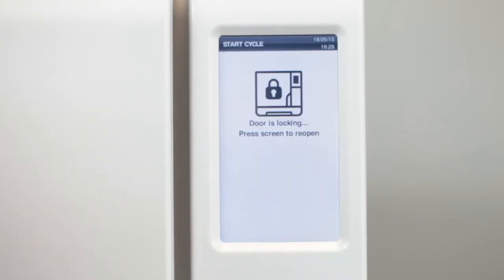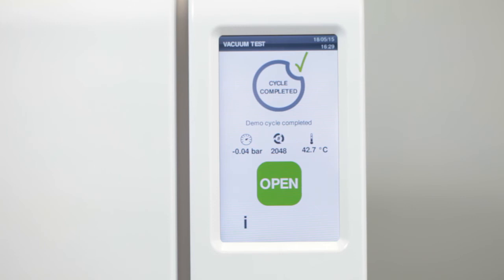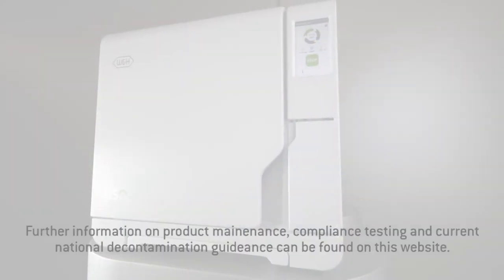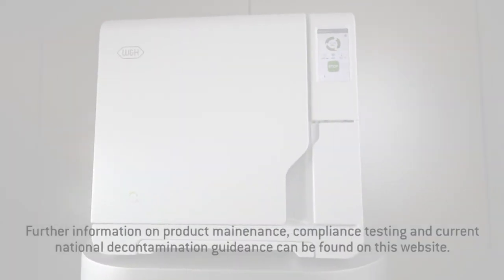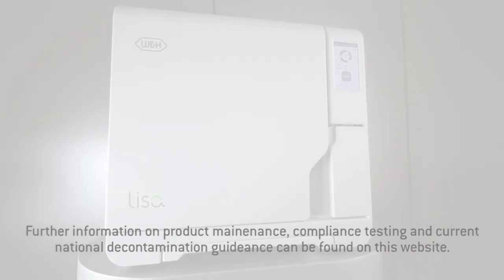You can open the chamber door as soon as the vacuum test cycle is finished. A notification on the touch screen of your Leaser sterilizer will inform you whether the vacuum test was successful or unsuccessful. The Leaser sterilizer saves the digital test reports in the device memory and also on the USB stick if available.